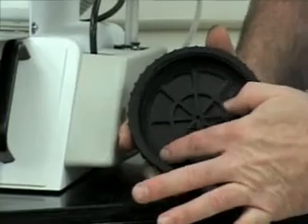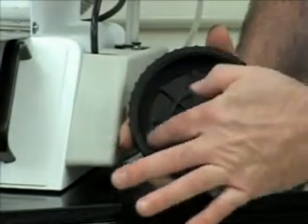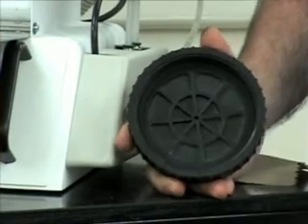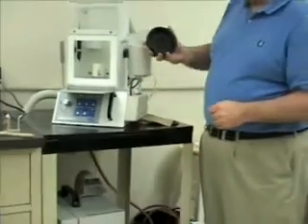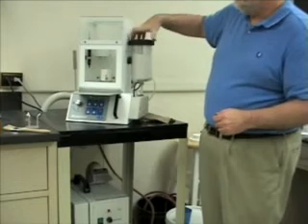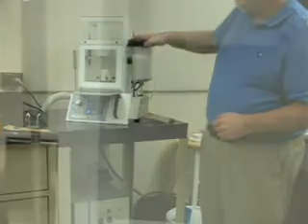I can feel the edge of the groove and the lip on the lid, and I can feel a nice uniform surface there. And so now we're done maintaining the lid. I'm going to replace it on the jar and give it just a bit of an extra snug there.